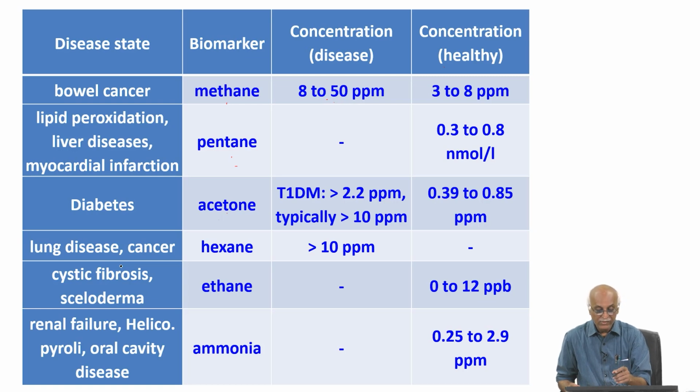So, basically in the last maybe 15-20 years, the focus towards establishing such biomarkers and measuring such biomarkers has increased. Still there are some limitations in terms of clinical applications. However, a lot of interest is there in order to develop such devices.